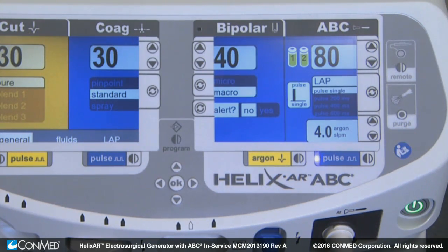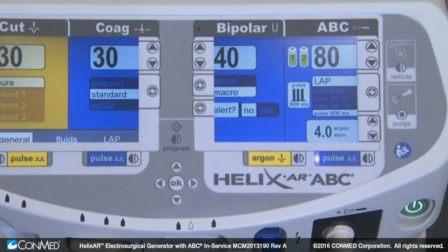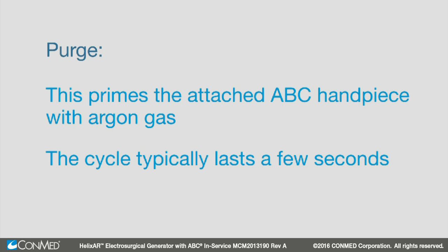The ABC pulse selection key toggles between ABC pulse on and ABC pulse off. When on, ABC pulse mode becomes activated and the following options become available: single shot, 200 milliseconds, 400 milliseconds, and 600 milliseconds. Once ABC settings have been established, press the purge button before starting ABC handpiece activation. This primes the attached ABC handpiece with argon gas. The cycle typically lasts a few seconds.